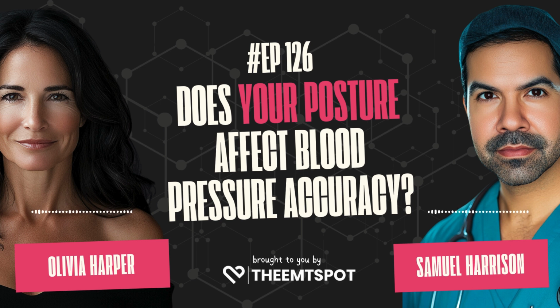Probably not, but a doctor named Dr. Wexler suggests something simple: having patients fill out paperwork in the exam room rather than in the waiting area. That way they have a few minutes to de-stress before the blood pressure cuff even comes out. That's brilliant. A simple tweak to the routine that could make a real difference. Any other tips? Both Dr. Wexler and Dr. Jurashek agree that home blood pressure monitoring is likely the most accurate way to go. It gives you much more control over the environment and allows you to take multiple readings at different times of day, painting a more complete picture of your blood pressure patterns. Home monitoring.